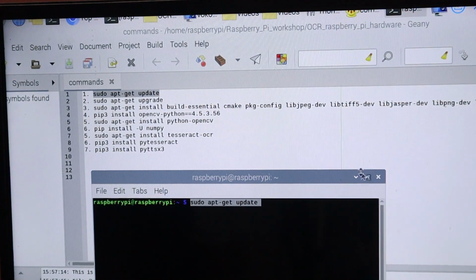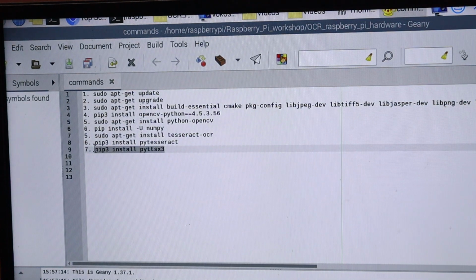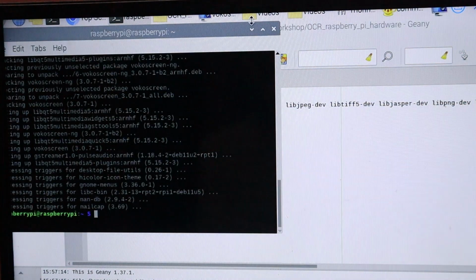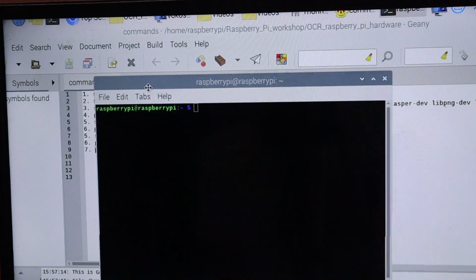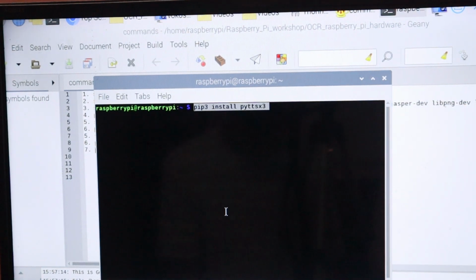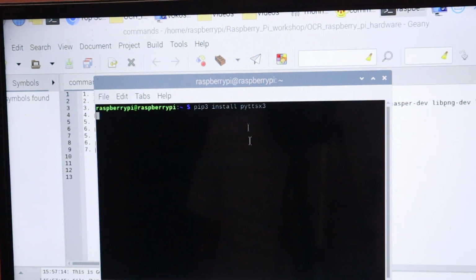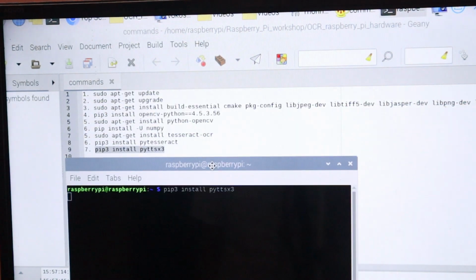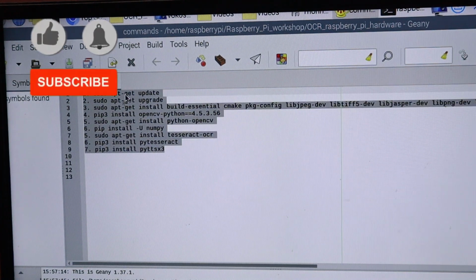Let me take another example command, which will take less time. Let's say I have to install this one. I right click here, copy, go to the black terminal, right click and paste. Once I paste, I press enter, and the respective package will install on your Raspberry Pi. In this way, one by one, you install the commands on your Raspberry Pi, and all of these are the libraries that we require for our project.